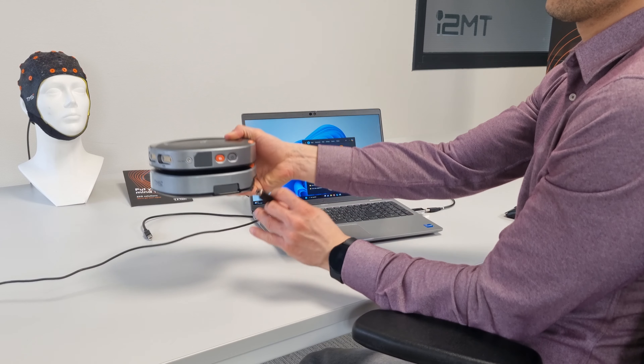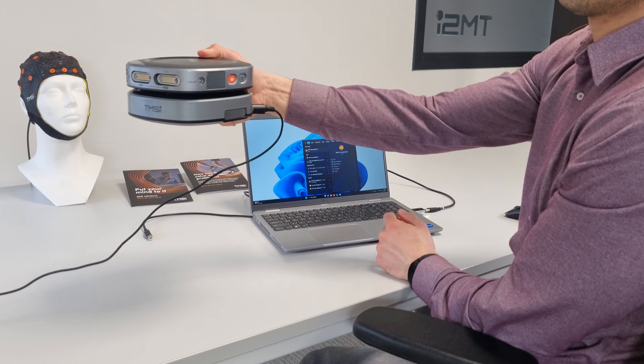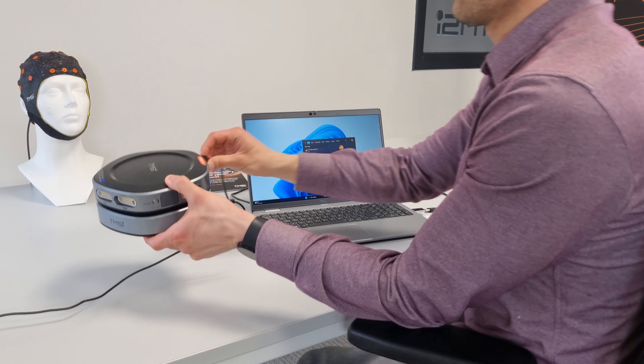When you are ready to power on your Saga, connect the power cable to the docking station. Pay attention to the orientation of the power connector. Once connected, the docking station powers up.